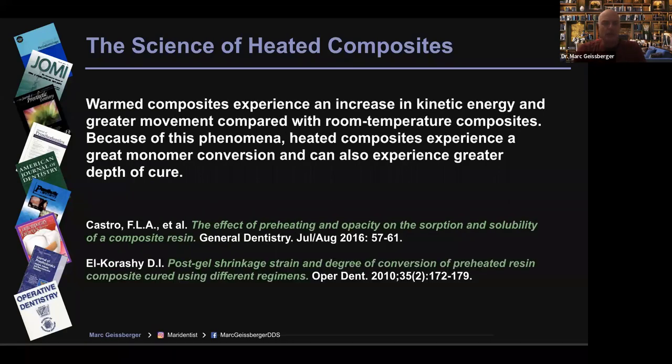Now, fast forward to far more recent data, and look at the Castro study or the Il-Kuroshi study that talk about the effects of heating composite on opacity, on the absorption of water, on the solubility of composites. And you see a lot. But what's interesting about a heated composite compared to one at room temperature is you get greater depth of cure, greater monomer conversion, greater hardness, and less solubility. And that's been well established in the literature.